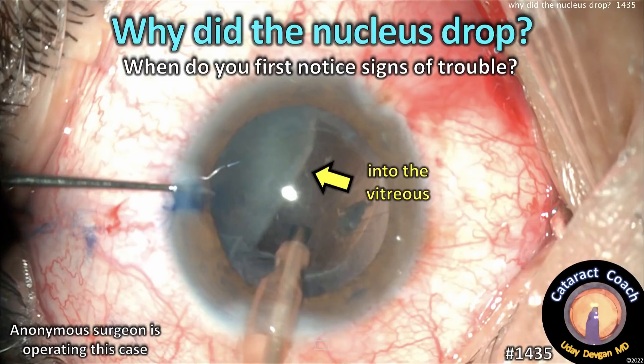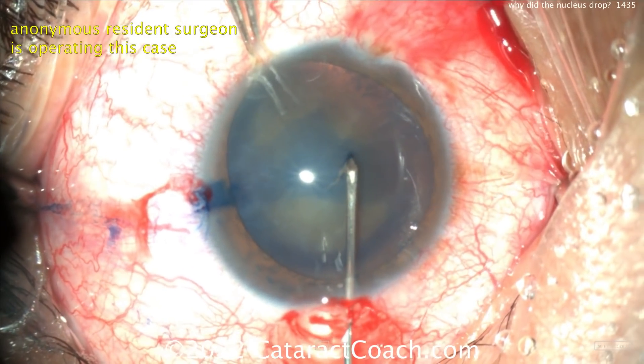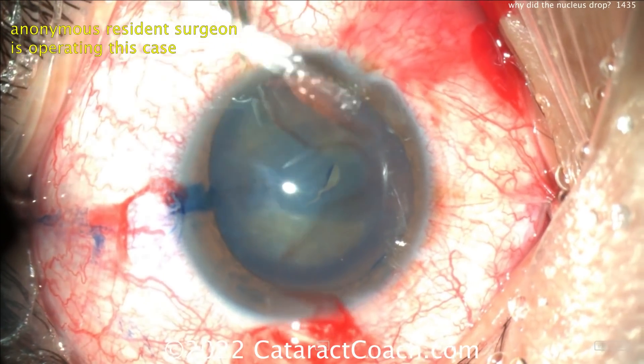CataractCoach.com — why did the nucleus drop, and when do you first notice signs of trouble? We have an anonymous resident who's operating this case. You can see it's a pretty dense nucleus, and the capsule has been stained with trypan blue dye.